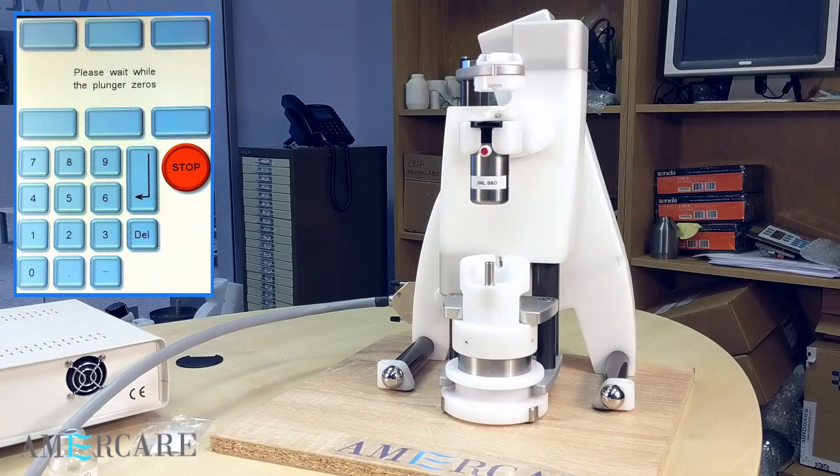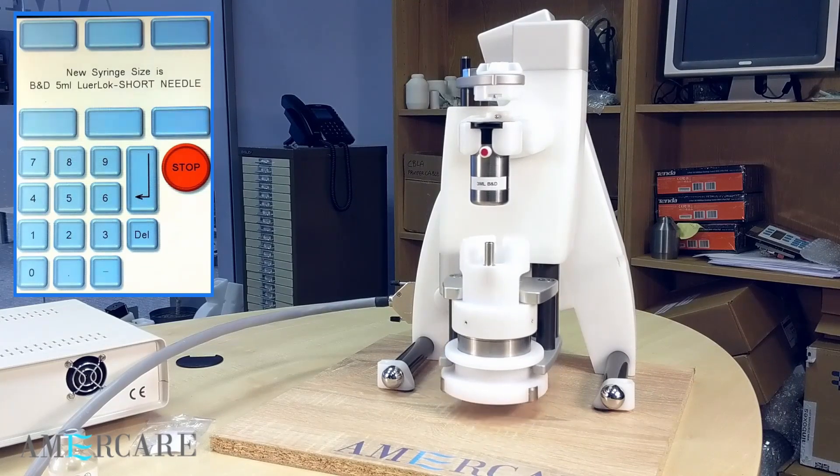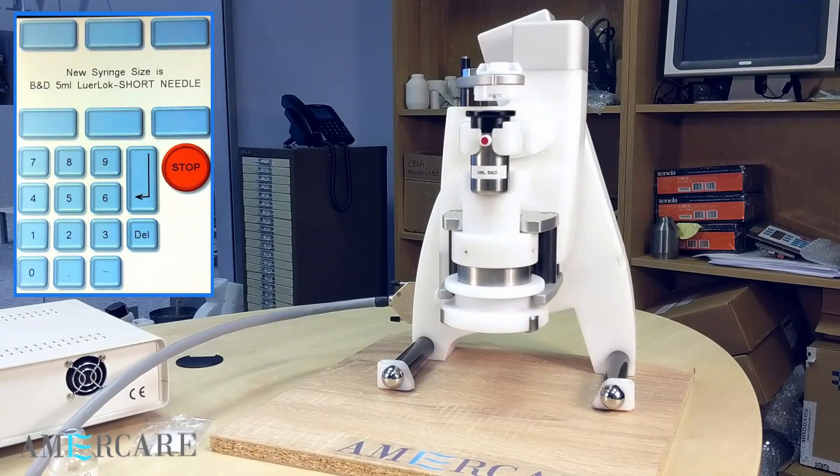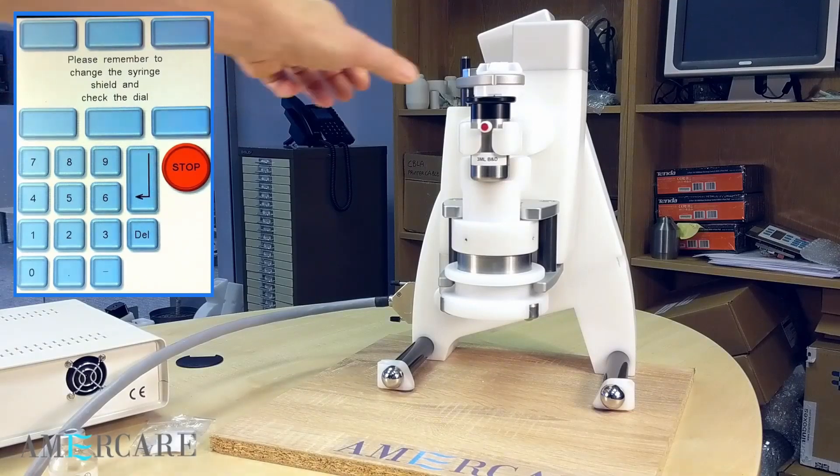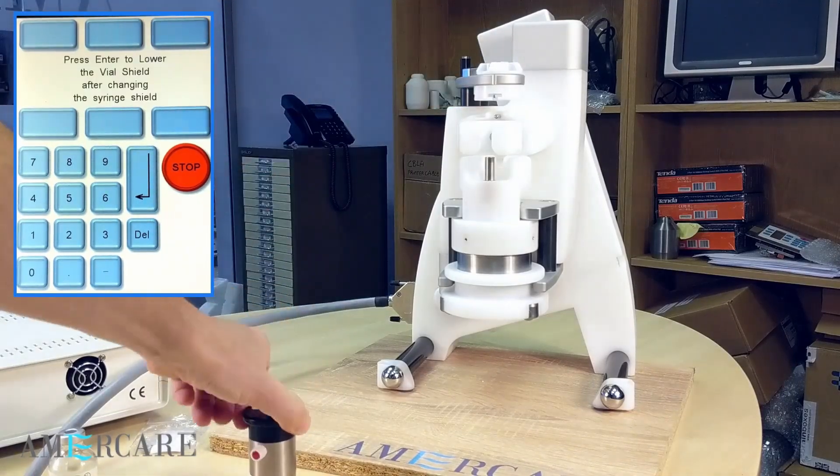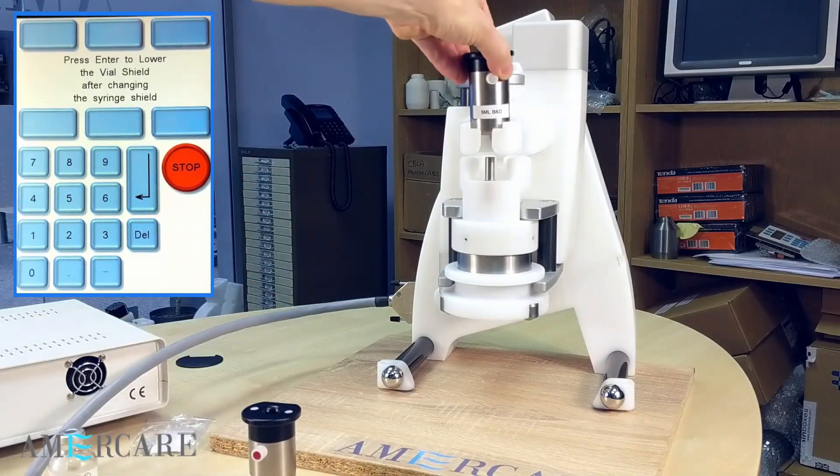The plunger will now zero. The carriage will raise, lifting the existing shield up to aid removal. Lift the existing shield out and fit the new shield.